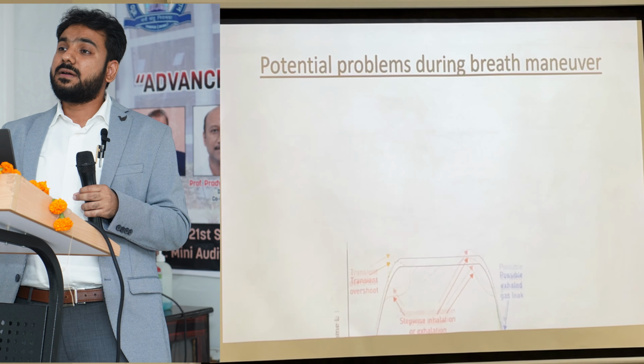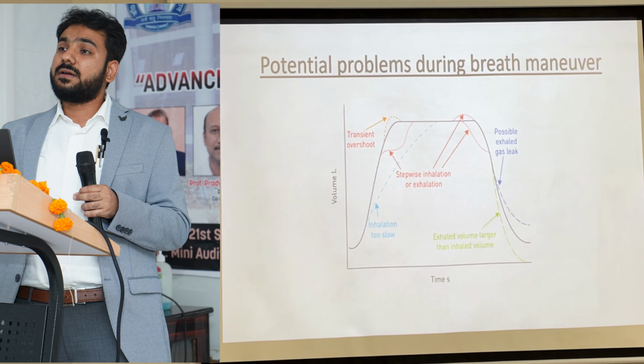Now, what can be the potential problems during the breath? If there is slow inhalation, it will change the dynamics. It can reach the equilibrium early, or there can be a transient overshoot, or stepwise inhalation or exhalation, or a possible gas leak at the end. We are not able to properly collect the gas in the sample mixture, or the patient has not fully inspired and is expiring more than what he took.